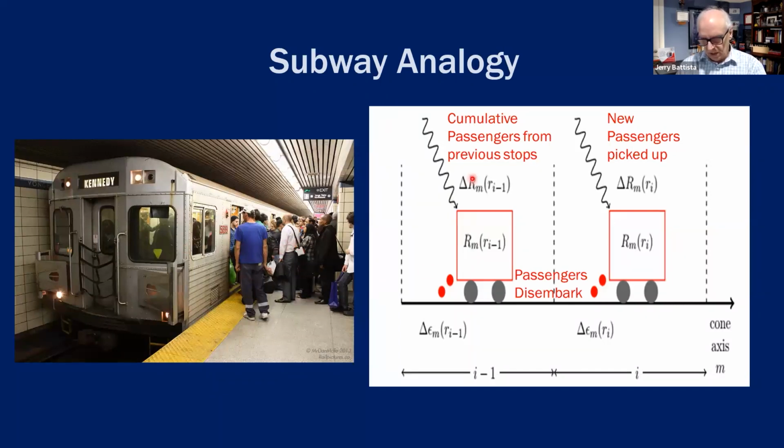And that's what the collapsed cone method does. It follows the amount of radiant energy within a voxel, and customers can get on the train, or they can leave the train. When they leave the train, it deposits dose along this line. And this goes on to the next station. Again, new passengers are picked up and some disembark, and you deposit the dose along there.